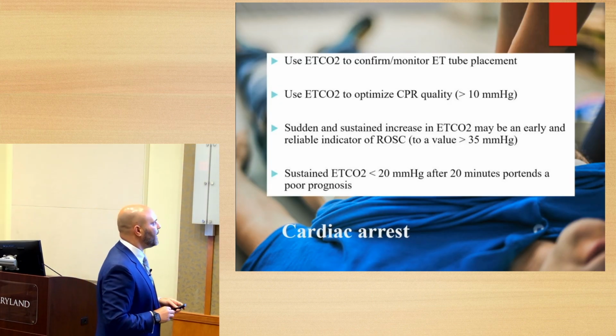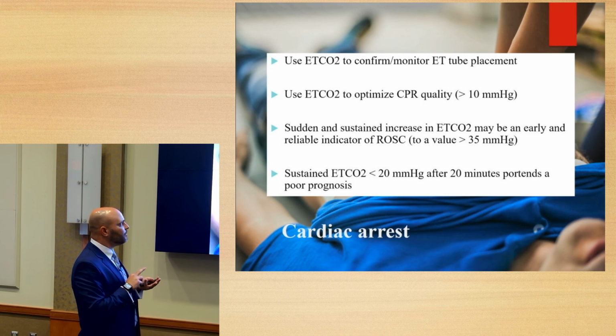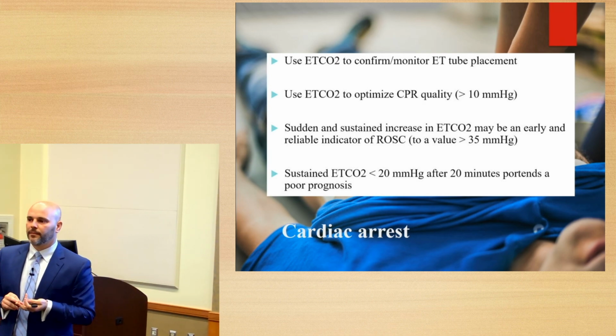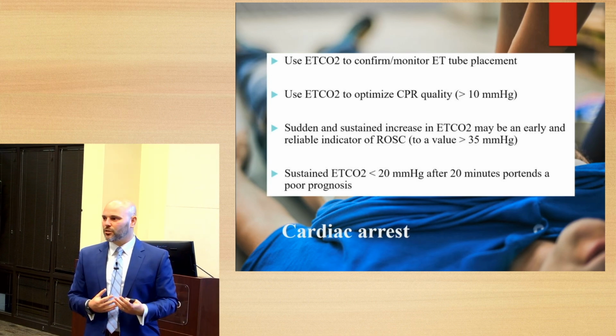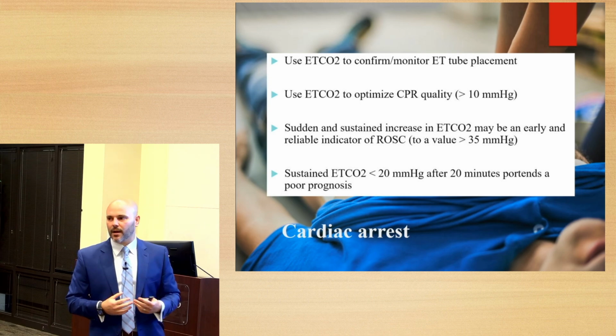Okay, so for cardiac arrest, it's going to confirm ETT placement. It's going to give you an idea of how you're optimizing your CPR early on. If it's rising, it might give you a good idea and correlation of ROSC. If it stays low throughout the resuscitation, it is a poor prognostic indicator.